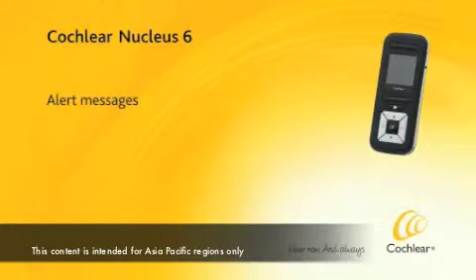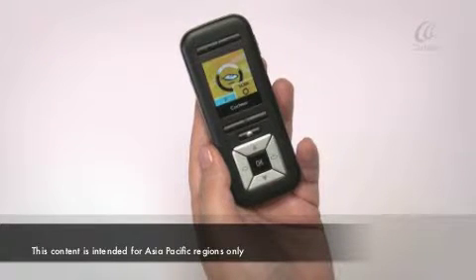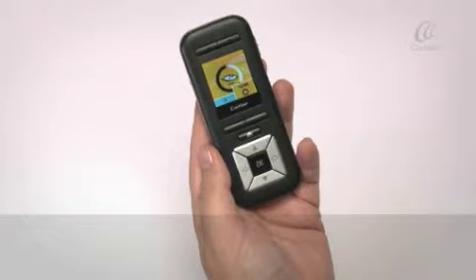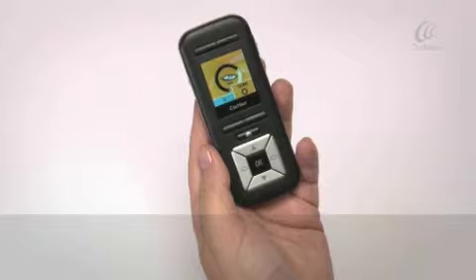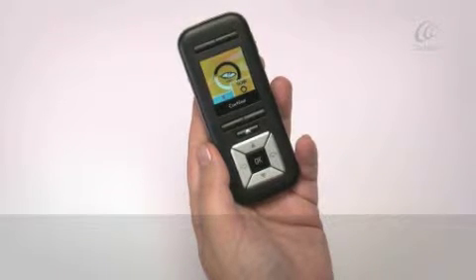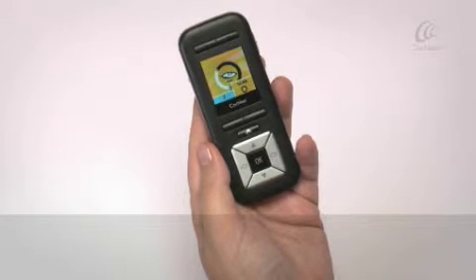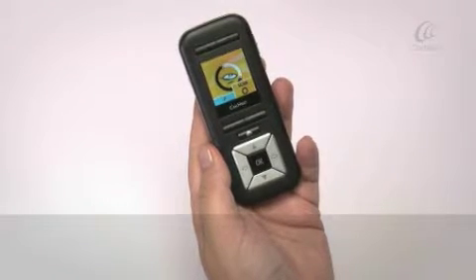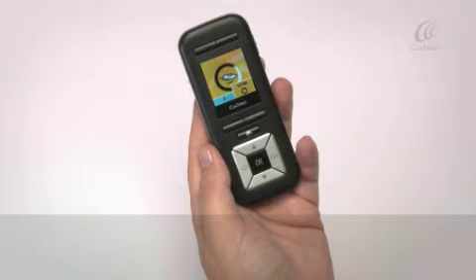Alert messages provide information about potential problems with your processor or remote assistant. For example, a low battery. However, you can change the setting to either hide or show alert messages.